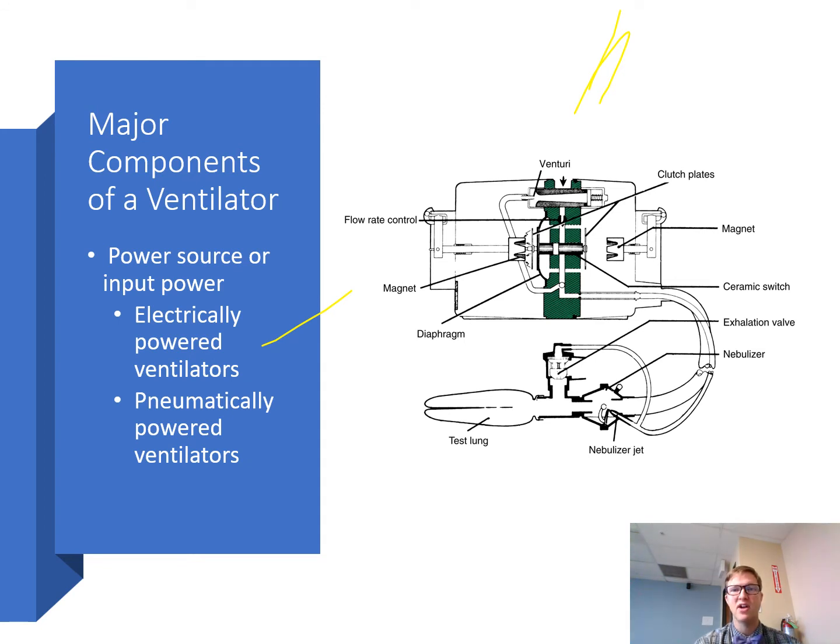So the ventilators are pre-programmed with modes traditionally that are stored in the microprocessors. And they can be updated pretty rapidly by installing new software programs. So you're going to have random access memory, or RAM, which also is incorporated into the ventilator central processing unit, that can be used for storage of data.